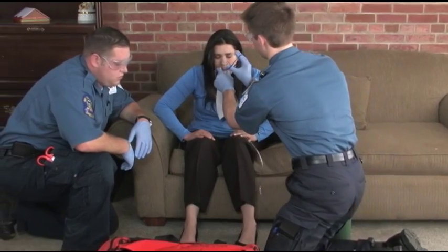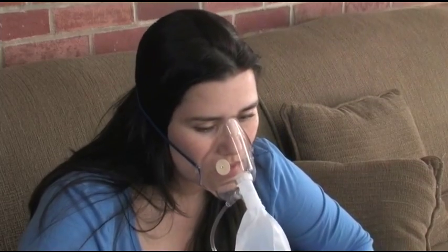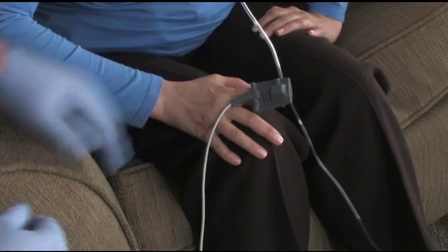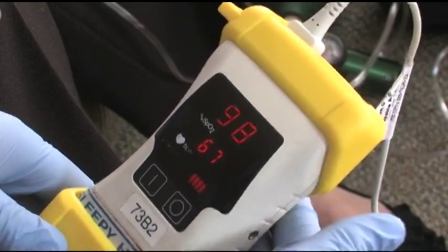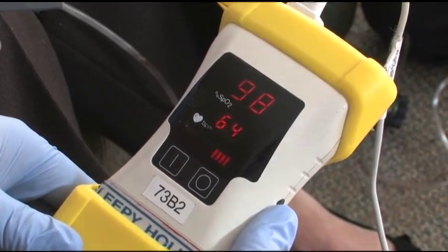Instead of relying solely on the pulse oximeter, incorporate it into your overall clinical assessment of respiratory rate and effort, skin signs, and lung sounds. Do not delay your initial assessment or the administration of oxygen in order to apply the pulse oximeter. A pulse oximeter is most useful in two situations: evaluating the effectiveness of any interventions you may perform, such as artificial respirations, oxygen therapy, or bronchodilator therapy, and alerting you to a deterioration of your patient's oxygen saturation.